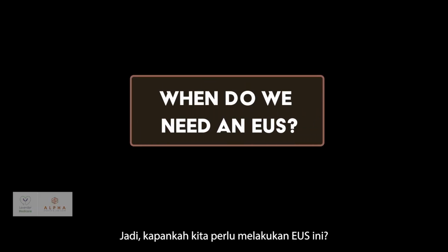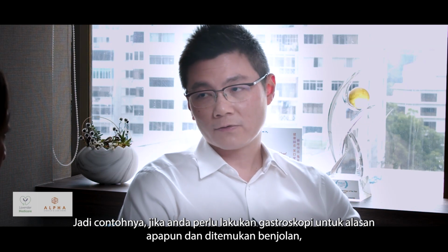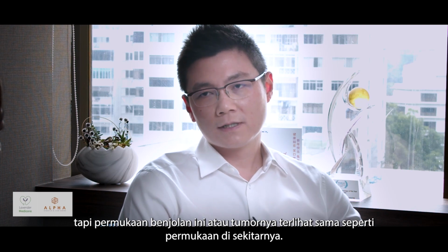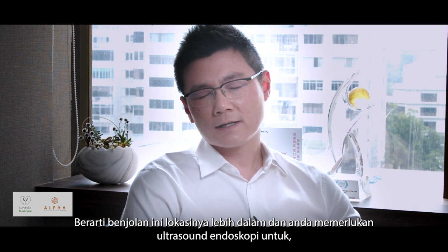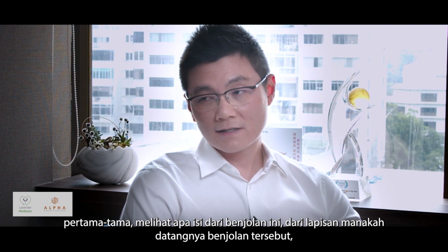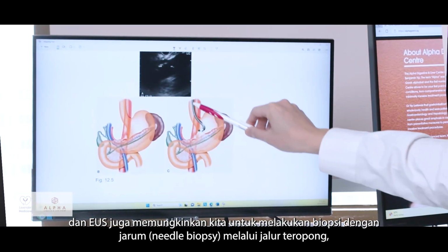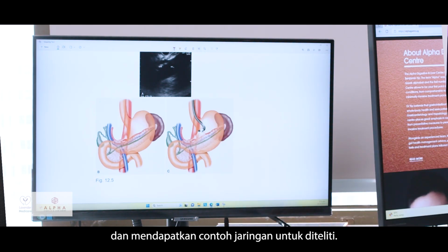So when do we actually need to do this EUS? So for instance, you do a gastroscopy for whatever reason and you find a lump, but the surface of this lump or tumor looks the same as the surroundings. So this lump is from deeper, and you will really need the endoscopy ultrasound to see first of all, what does this lump consist of, which layer is it coming from, and also EUS allows us to put a biopsy needle through the working channel of the scope and obtain biopsy samples for diagnosis.